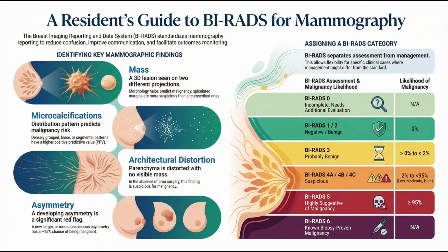But the recommendations for what to do next, the management, that often differs, even if the language to describe a finding is the same. Absolutely. The descriptive lexicon, the calcifications, margins, the shapes, all of that stays universal. A spiculated mass is a spiculated mass. But the application changes. For instance, annual screening mammography isn't typically appropriate for men. So it really makes you think about how a universal, standardized lexicon still has to adapt its application to provide tailored care for different patient populations.